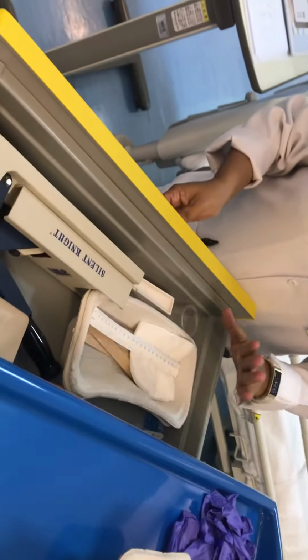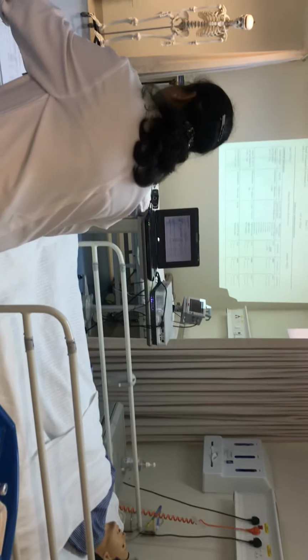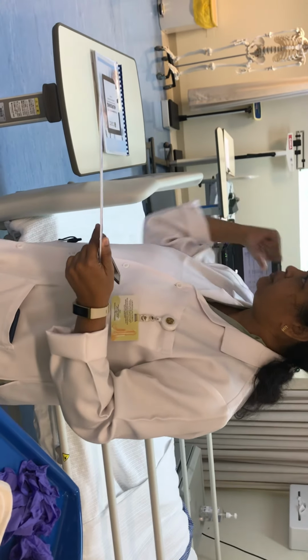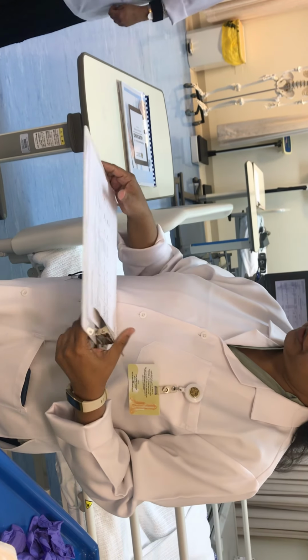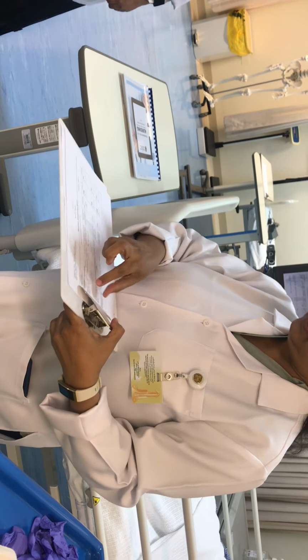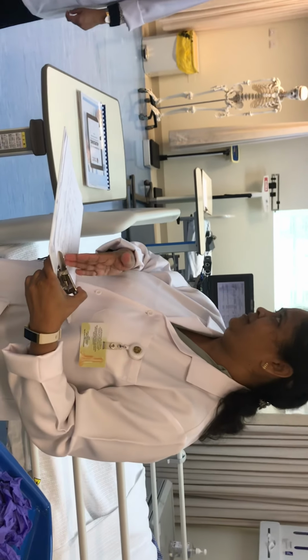Anything I need from there. Okay, when I come to intradermal and all, I need it. Now I should have my things ready for injections. Remember, first you don't go to the patient. First should be the MAR, because you should know whether it is time for you to give the medications or not. You need to read from the MAR, even if it is IM or everything. First you should know the action. For that sake, the student should read the MAR.